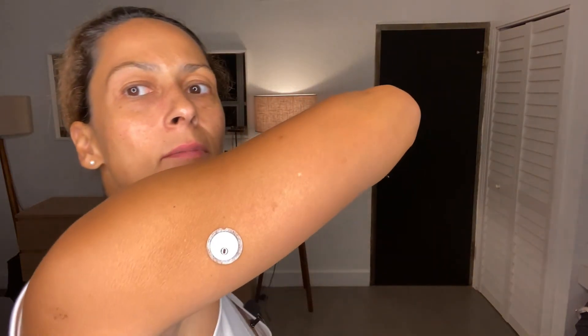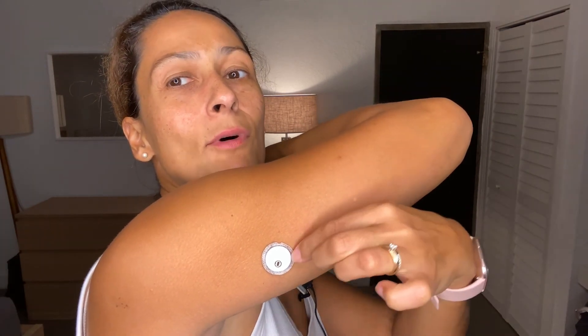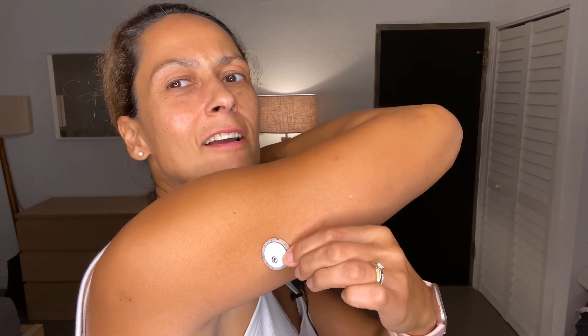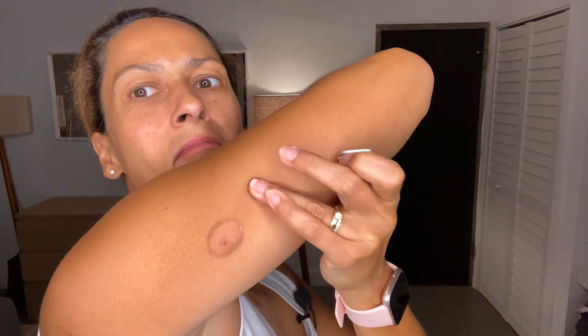It's been two weeks — time to take off that sensor. You can see it's peeling a little bit at the edges. Just pull it off. It was sticking a bit but there it is. I need to clean that up, but that's the sensor. And that is how you get started with the Freestyle Libre 3.